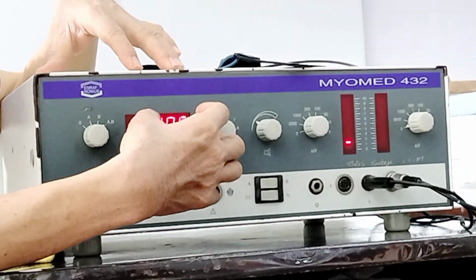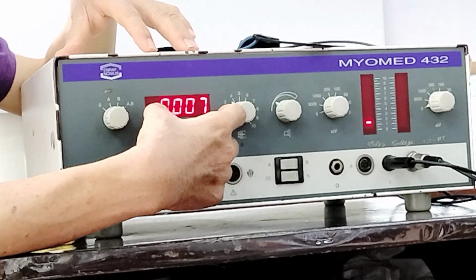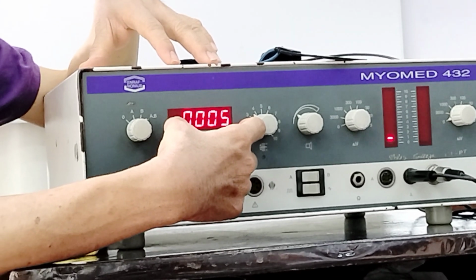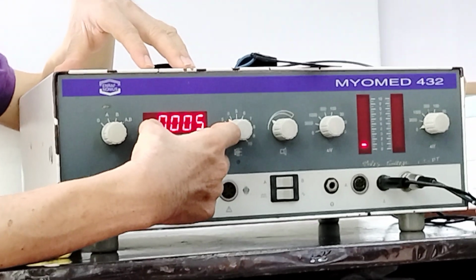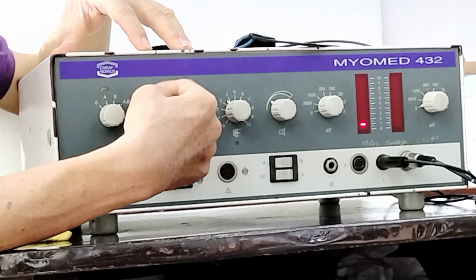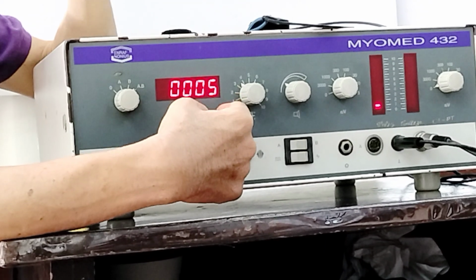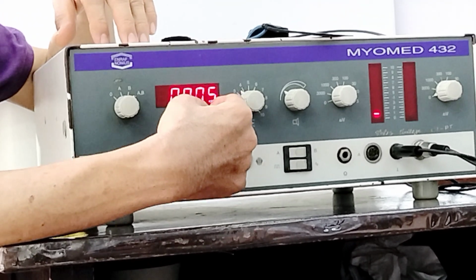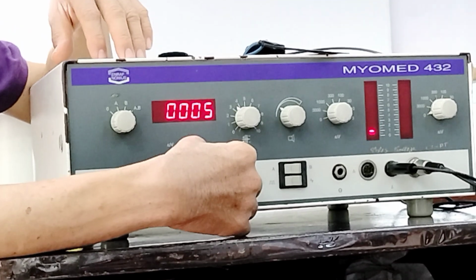Sorry. So, take note, this is a digital display, so this will be a visual signal. Visual, so the patient can see it, and not only the patient but also the therapist. As I mentioned, one of the findings of biofeedback is that the therapist can monitor the condition of the patient.